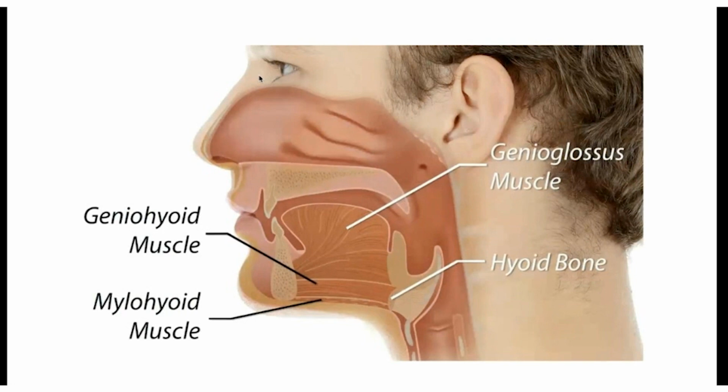So the way that appliances work, just a quick anatomy review. All the muscles of the tongue and throat attach to that lower mandible. By bringing the mandible forward, you're going to prevent the collapsing of the tongue, but you're also going to provide support to that hyoid bone, which is that free-floating horseshoe-shaped bone that muscles of the tongue and also the throat muscles are attached to. So you're supporting the hyoid bone so it does not collapse.